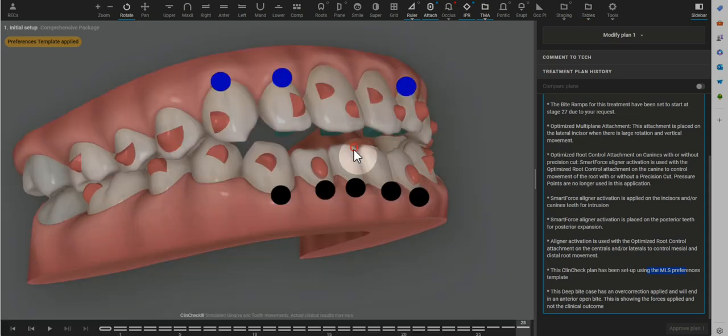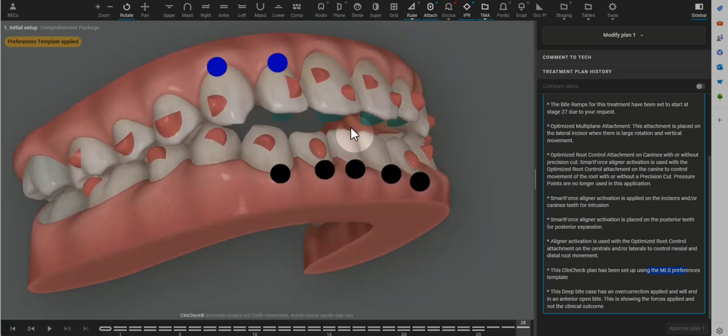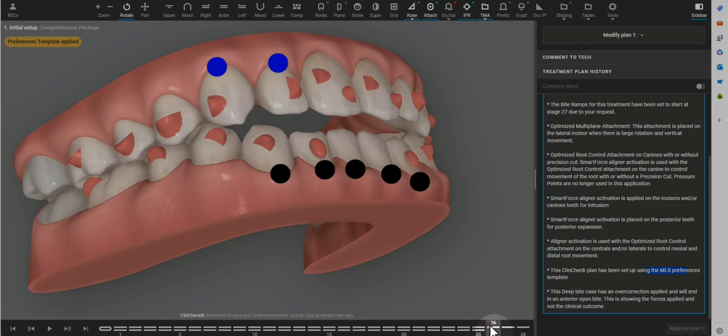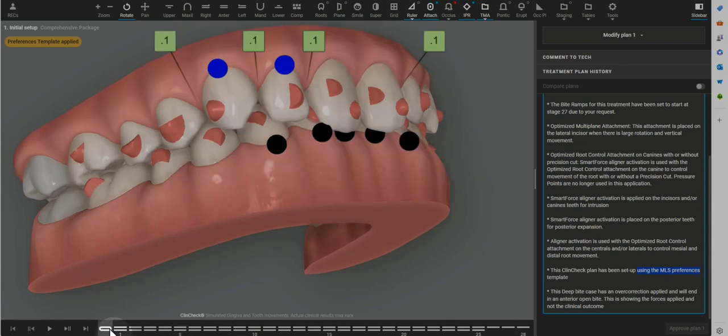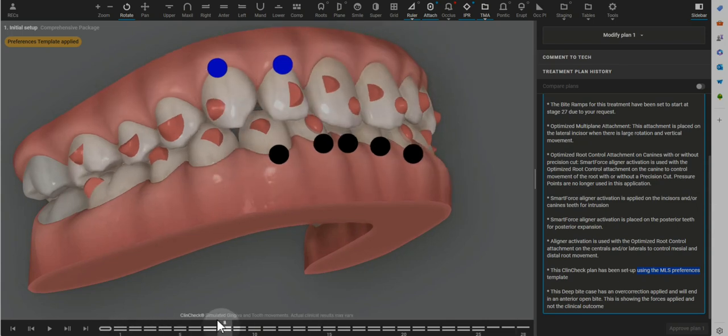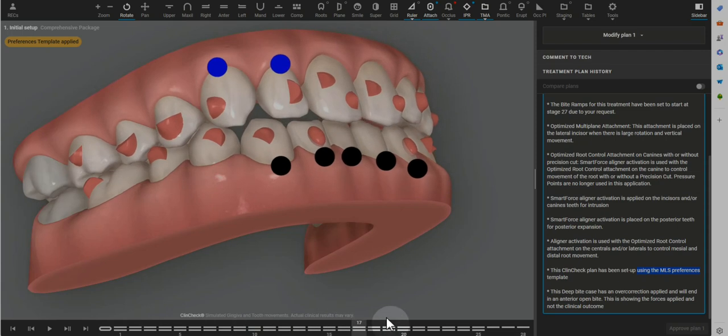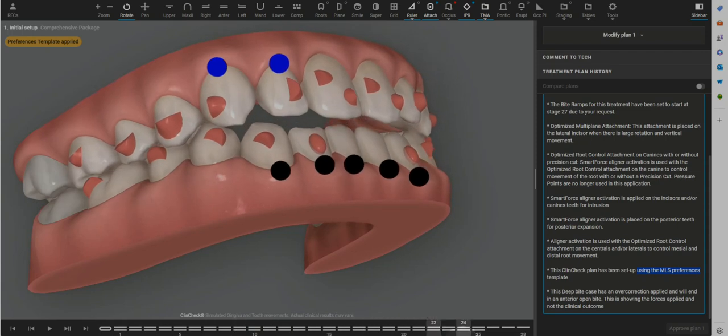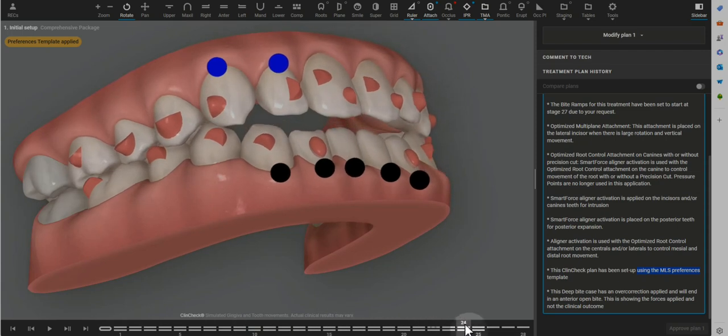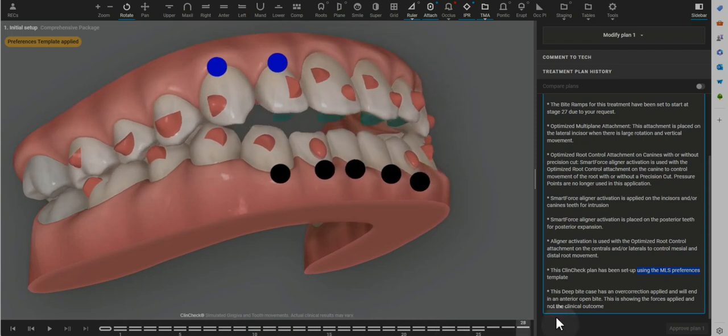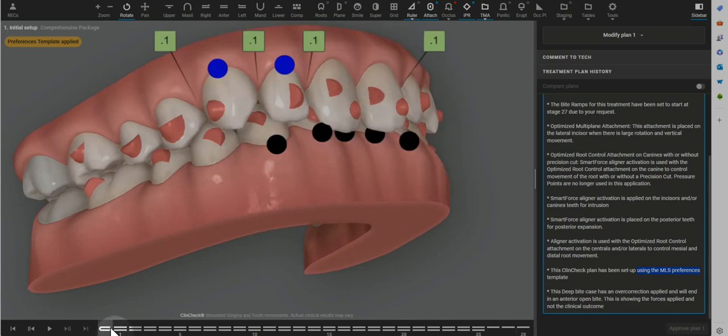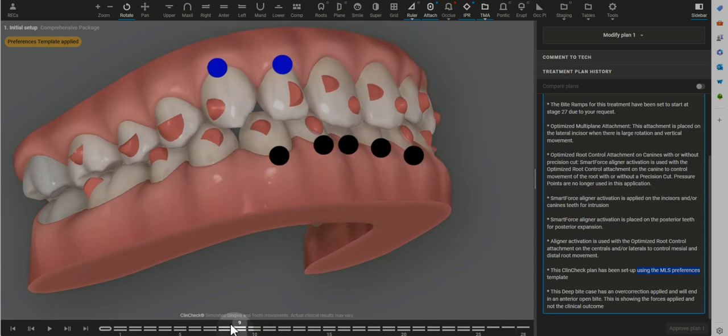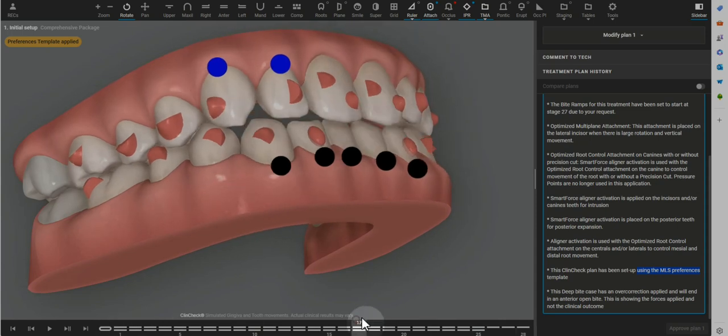Other big change that I would make would be to not delay the bite ramps. The MLS template preferences, I believe, prefer the bite ramps to be at the end of the case with the premise that bite ramps are a negative patient experience. Myself, over ten years using bite ramps, as well as so many people in the AACA community find that patients actually really like bite ramps.